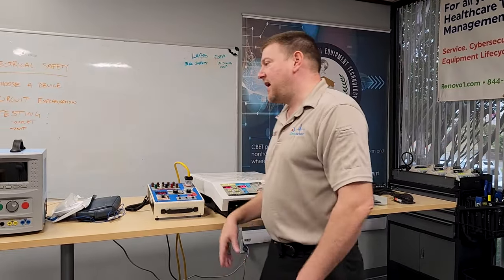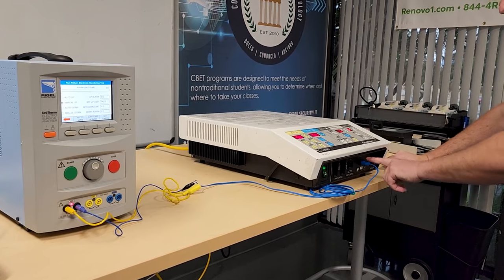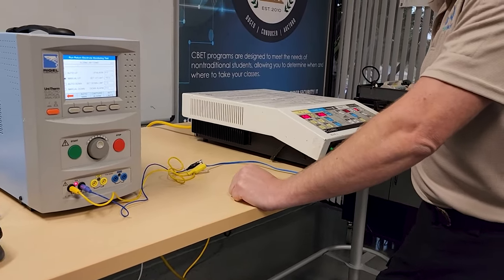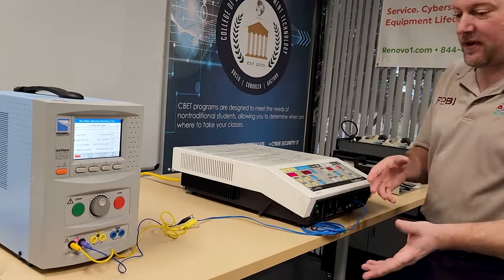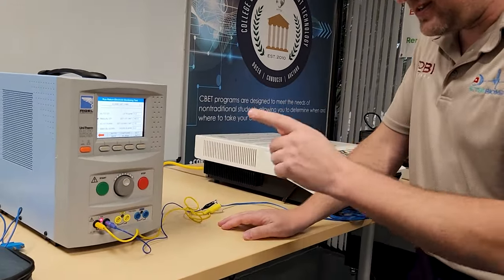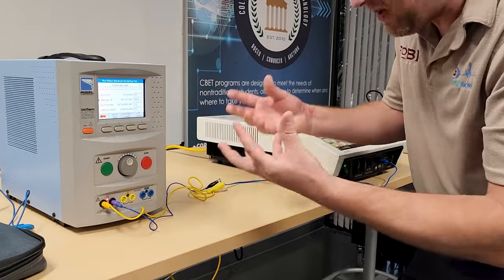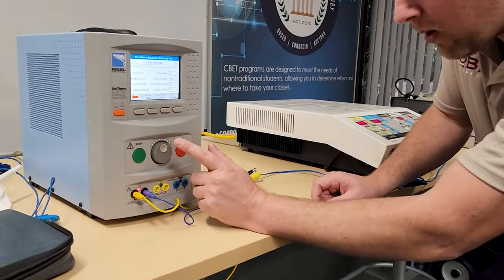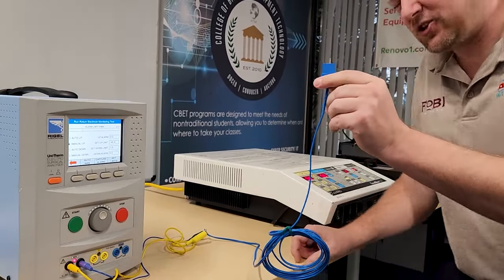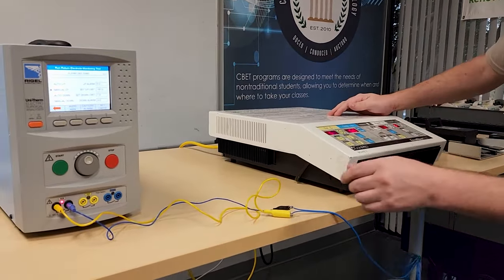Electrical safety is fine. Now I can plug it into the wall and hook up our Unitherm for energy checks. The first test is the REM — or CQM, depending on the manufacturer — which involves the patient return electrode. It's the number one safety feature on ESUs keeping the patient safe, and in this case would also keep medical staff safe. Since we have a reported burn on the arm of med staff, if they were burned by this unit there's a good chance the patient was burned too. On the Rigel, I navigate to REM and set it to manual. At zero ohms — dead short — this unit should give me error codes for split-pad electrodes.